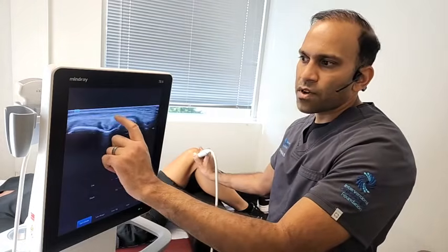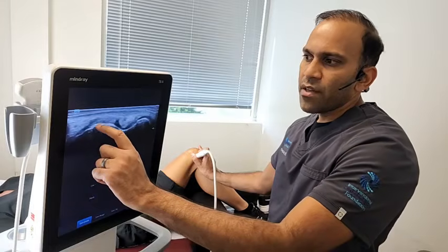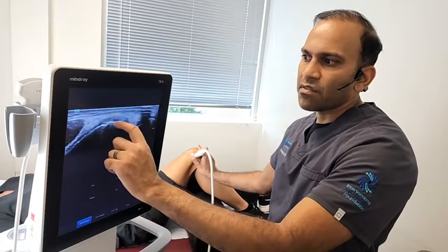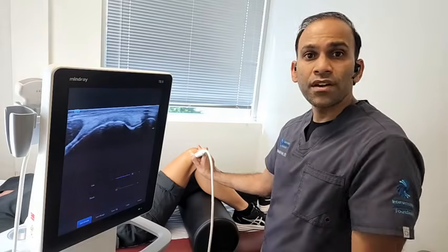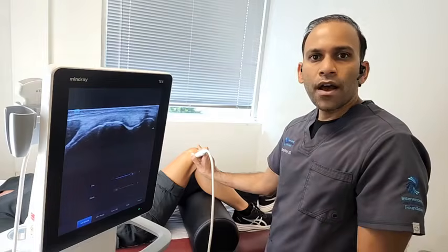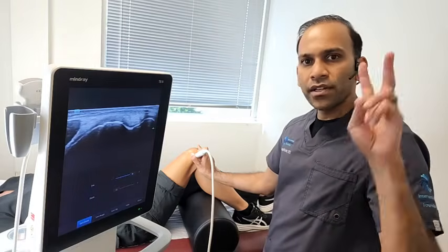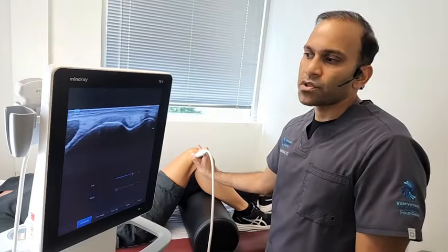We can follow that back over to the femur, and it's in this area over here that sometimes if we see a pocket of black, then that would be suspicious of something like a bursitis over here. And sometimes people can feel a rubbing pain in that outside portion of their knee. That could be an iliotibial band bursitis or iliotibial band friction syndrome.